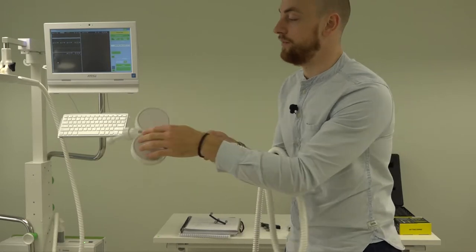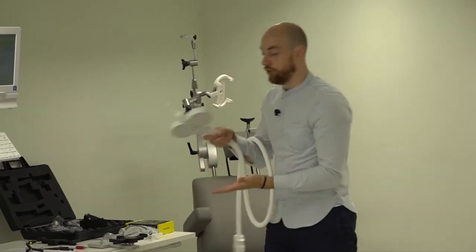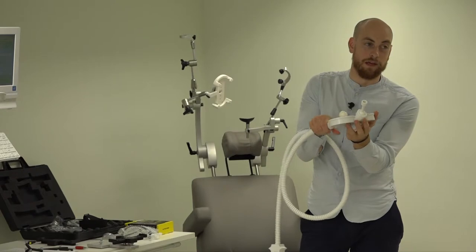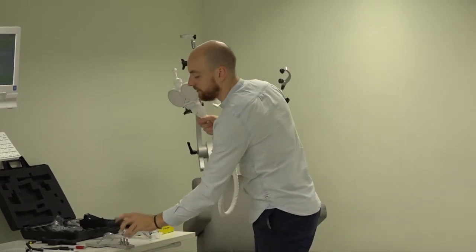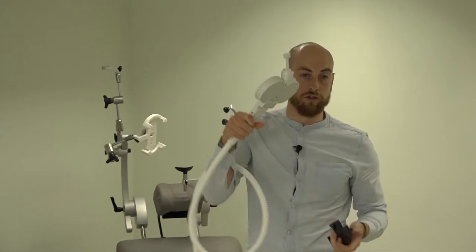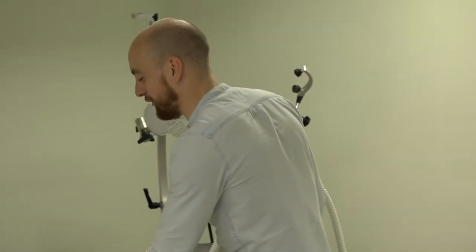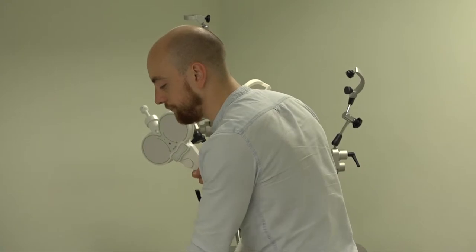One thing we have noticed is the bottom of it is interfering with the calibration block. Normally you want that sat dead flush, which it would normally do, because these aren't normally here. So we'll either have these remanufactured, so this bit doesn't sit as proud, or we'll have a little bit shaved off so it sits flush again. That's something for me to work on when I get back to the office on Monday, to come up with a solution for that. It shouldn't be too long.